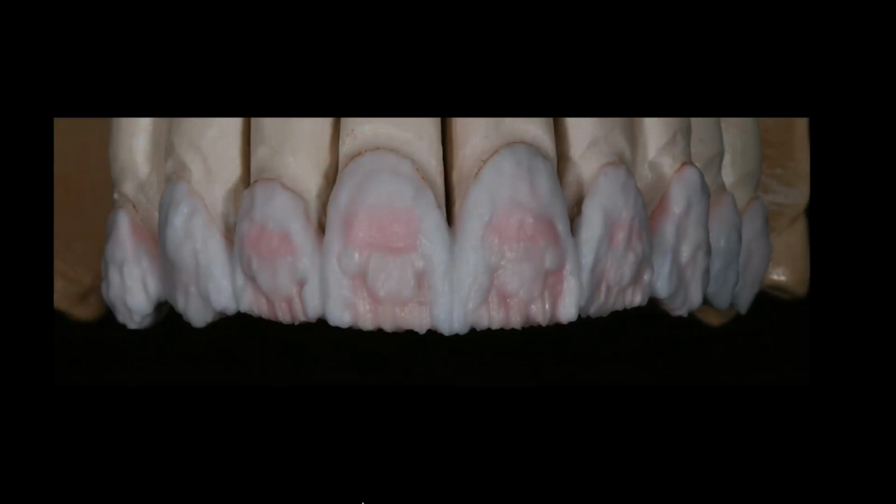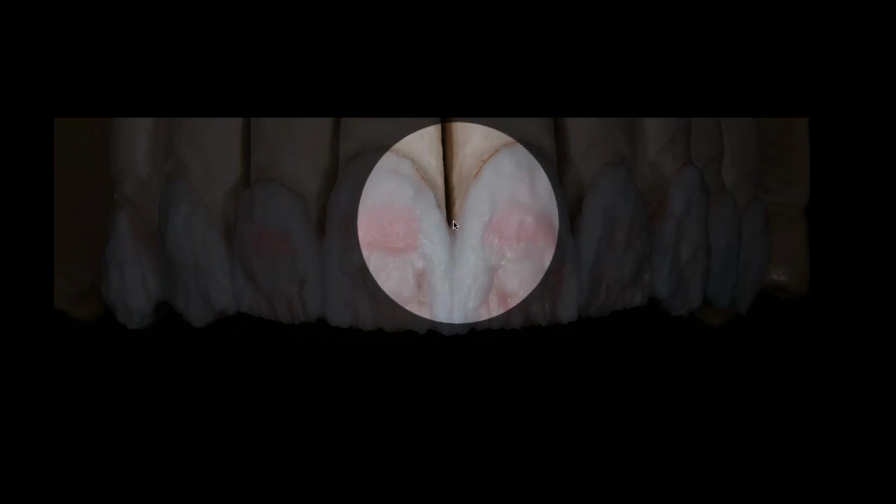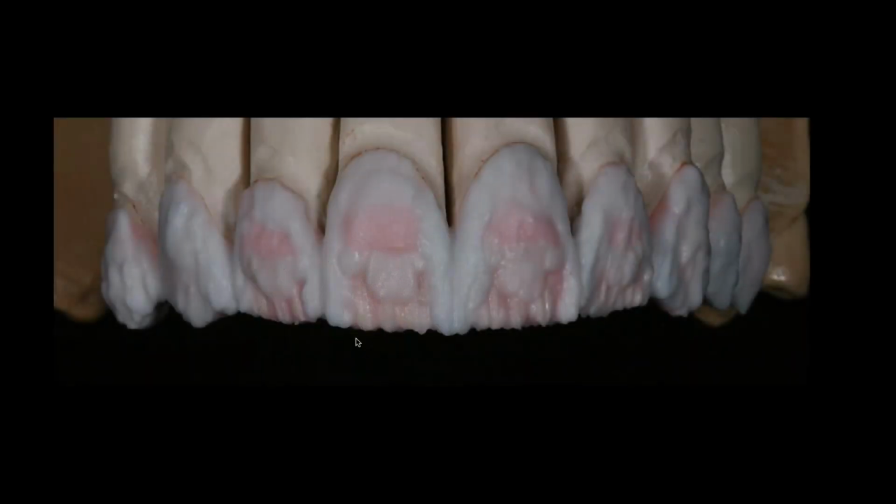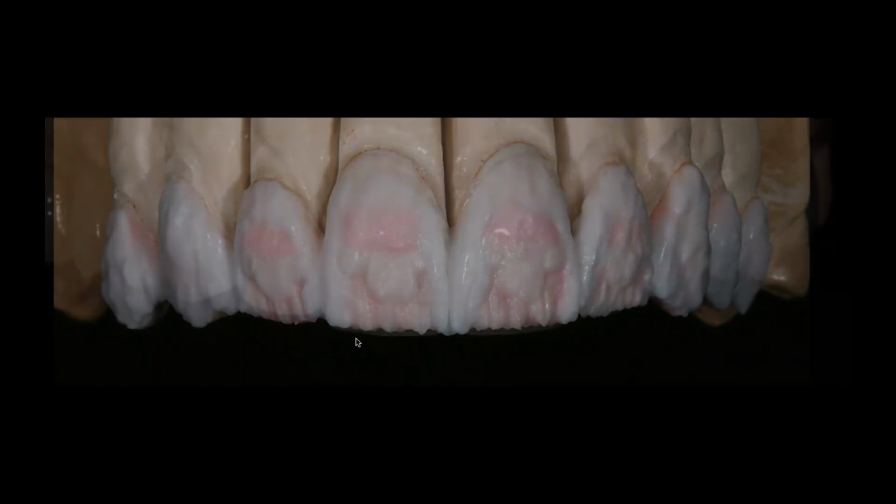So let me give you an example of that. This is an older buildup from a long time ago. I've changed my build-up style so much, but it's an interesting shot to show because even back then, when I was developing the concept, I was working with more opacity, more chroma, value, translucencies and effects. What I want you to understand here is that whatever I built is really the core of my restoration. And now I have the option of filtering that with my ceramic. So watch what I mean by that.